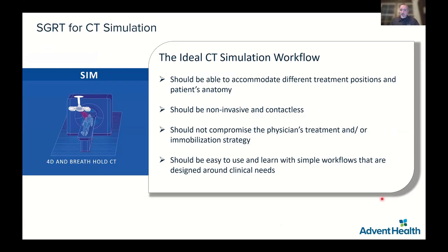Starting in CT, we're just going to follow the path of a patient through our simulation process all the way through treatment as we go through this talk. But when we were looking at introducing SGRT for simulation, we polled our clinicians and our therapy staff and wanted to know what were the most important features of a 4D CT simulation technology. These are basically the top 4 things that came out of that.